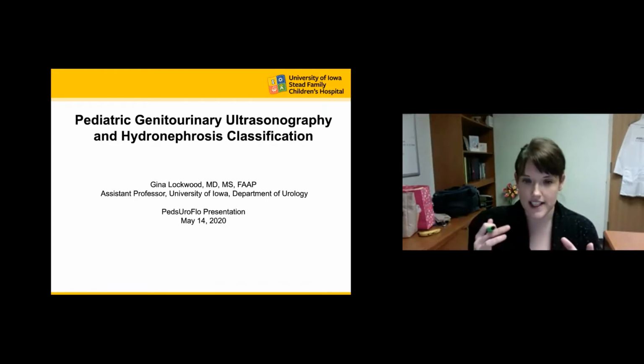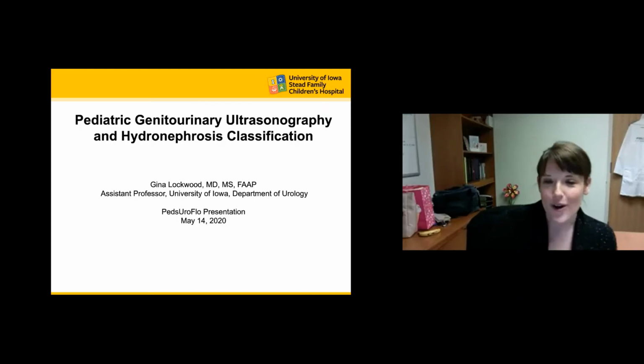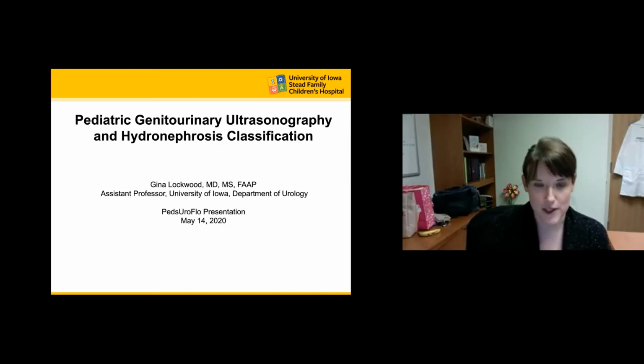I will start out by saying that hydronephrosis and urinary tract dilation, I'm going to use interchangeably throughout the presentation. We are really trying to use the UTD classification system, but it's really hard to teach an old dog new tricks, and I still say hydronephrosis, and I'm still not broken of that habit. So just know that when I say hydronephrosis, I mean UTD and vice versa.